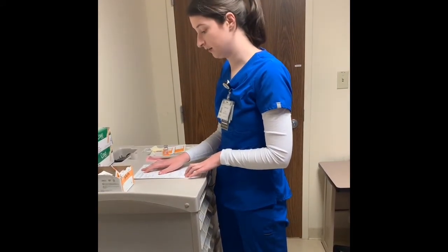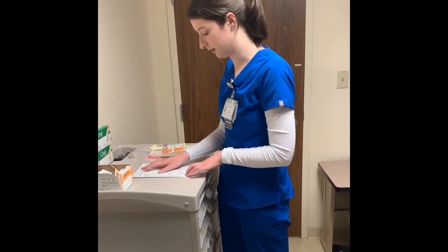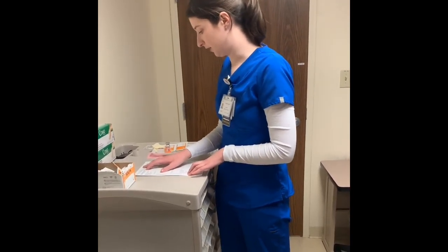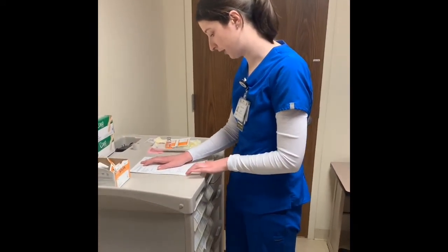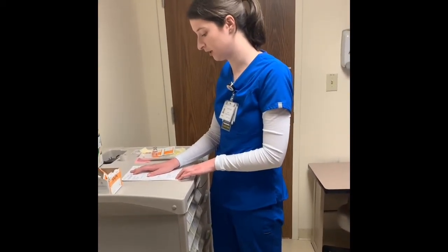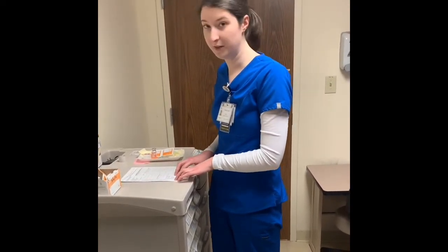Alright, so now for calculating my dosage that I need to be giving, because this is a regular insulin order, I will be dosing it based on the sliding scale for regular insulin administration, based on the fingerstick blood sugar of my patient. The most recent fingerstick blood sugar level that was taken was 355, and according to the scale that I was given, any fingerstick blood sugar levels between 351 and 400 should receive 20 units of regular insulin, so that is how much I will be giving.